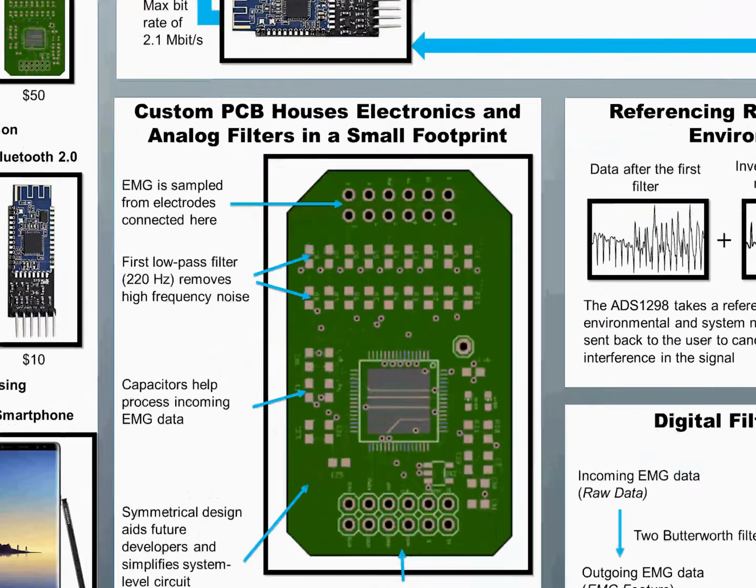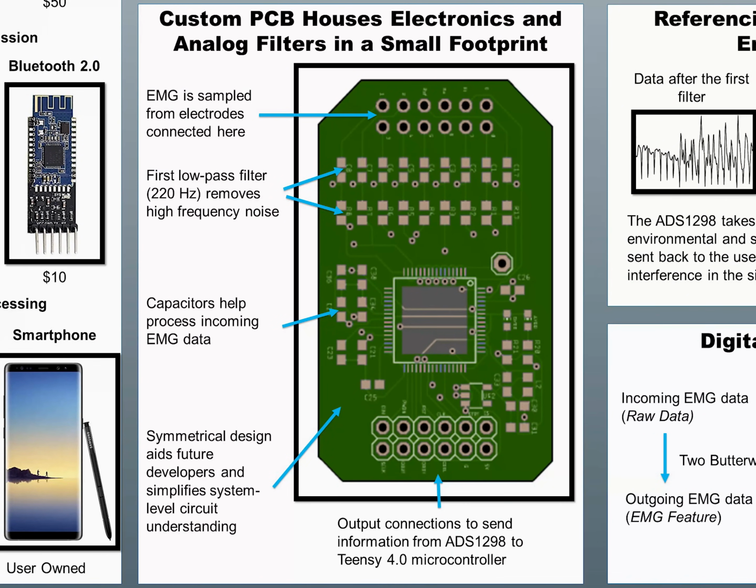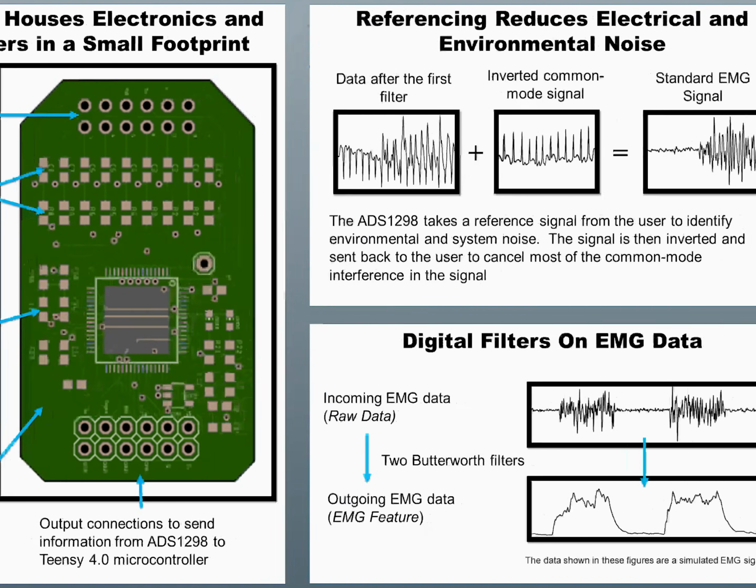Let's spend a little more time talking about the custom circuit board. A lot of considerations were made while designing this board. There was an emphasis on minimizing the space it took up, but also having a clear layout that could be easily understood by future developers. The raw EMG data comes in from the top via the electrodes. It then passes through a hardware filter and then onto the ADS-1298 itself. This data is then passed out the bottom side of the chip to the microcontroller.